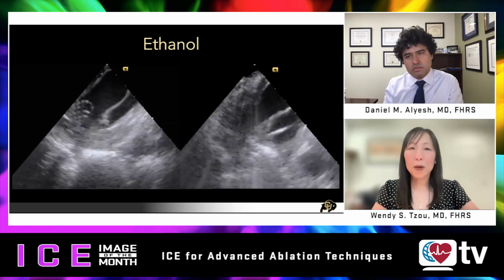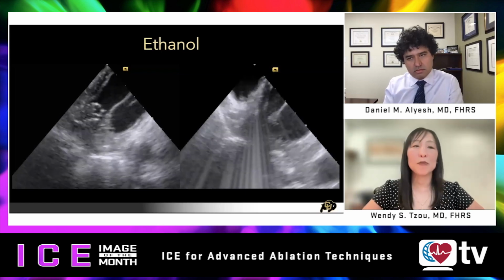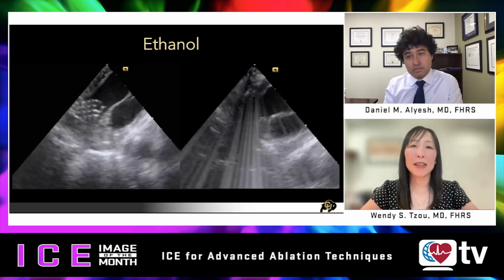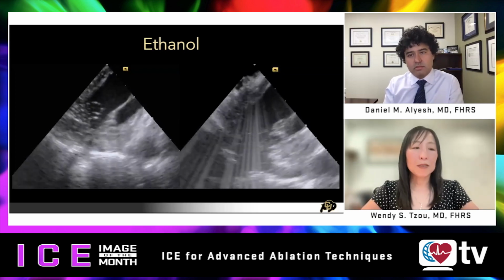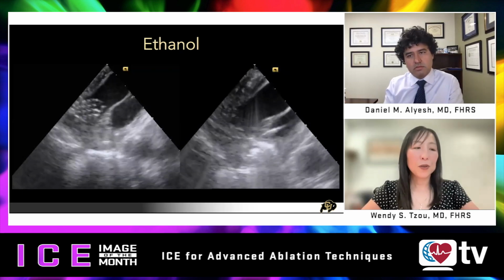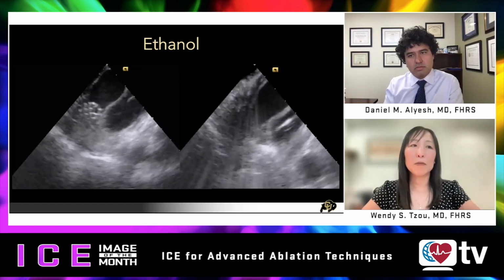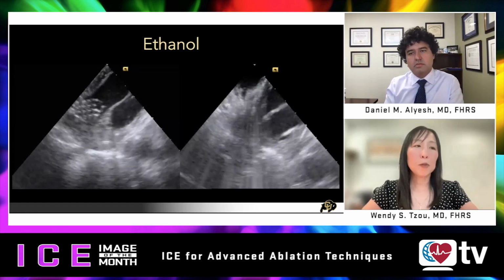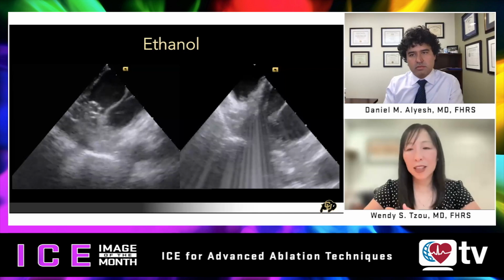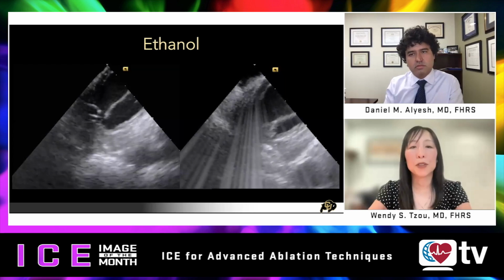So I think a smarter approach, which one of my partners, Lohit Garg, along with Sanjay Dixit at Penn, published, was this concept of priming the tissue from the beginning and maintaining it for an even longer period of time. So using lower power but more sustained ablation. I think it was a paper by our group too, Dewey, when he was here, that showed that if you started with higher power at the beginning, you had a much larger impedance drop, and you were more likely to get steam pops than if you started off slower. So that's been the approach that I have adopted before going to these more alternative approaches.